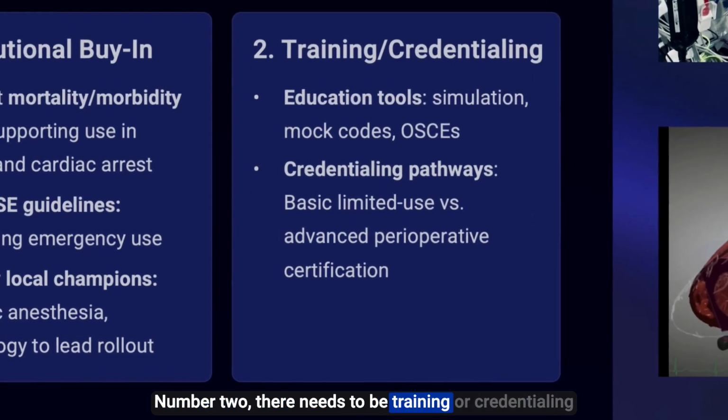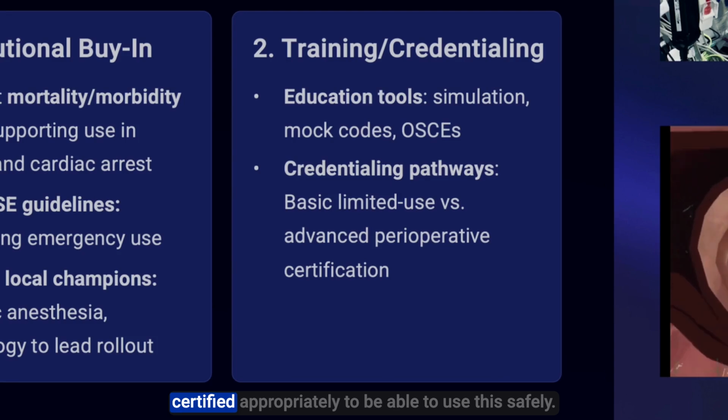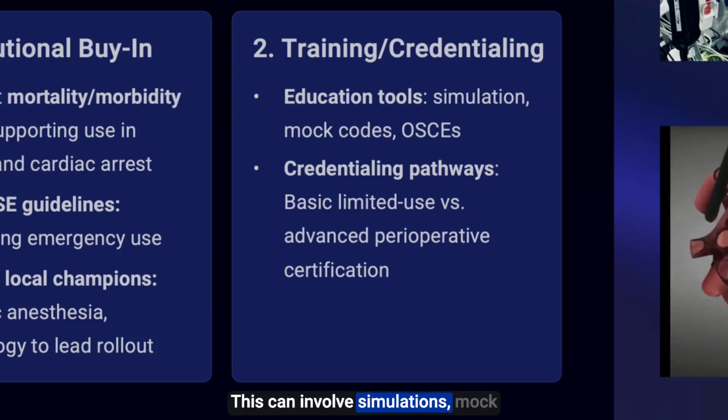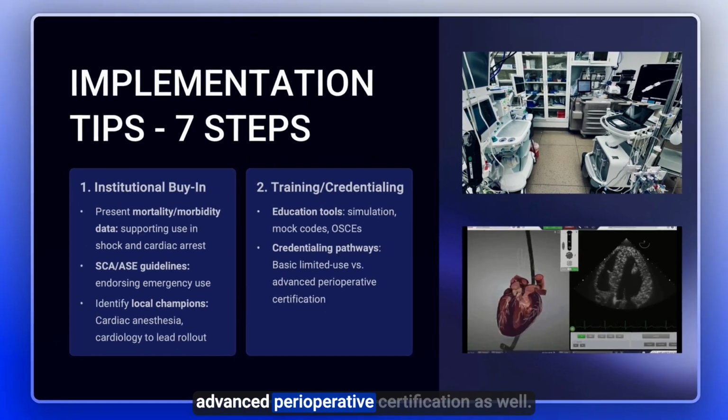Number 2, there needs to be training or credentialing pathways to make sure that people are trained and certified appropriately to be able to use this safely. This can involve simulations, mock codes, a basic limited use amount, or an advanced perioperative certification as well.